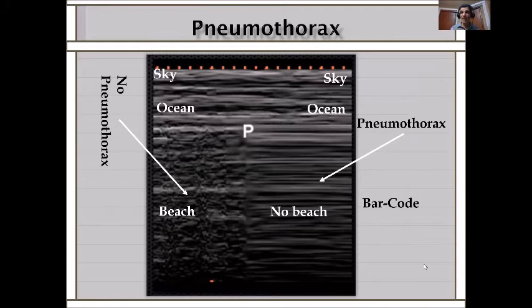And because there is air after the rib, you will see the shadow of the rib again. So either you see a shadow, but if you have excessive air, you don't see the shadow. You will see a mirror image of the rib. So either you see a shadow, which means you will not see anything behind because all the ultrasound waves are absorbed and that area will be black because it's absorbed everything. And any other thing, there will be a shadow of it. Then behind it you won't see anything because it's absorbed everything.